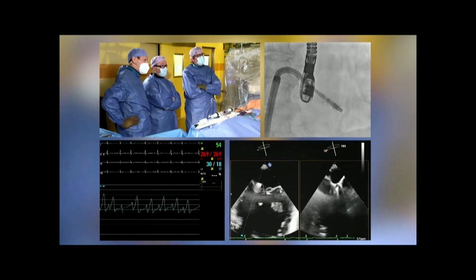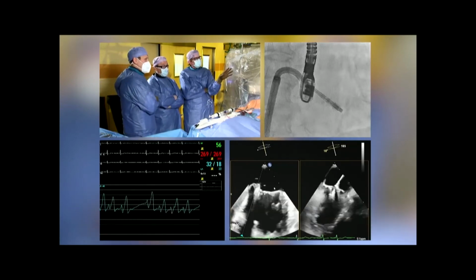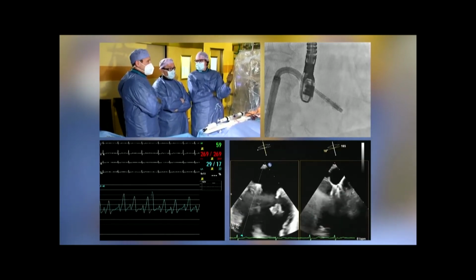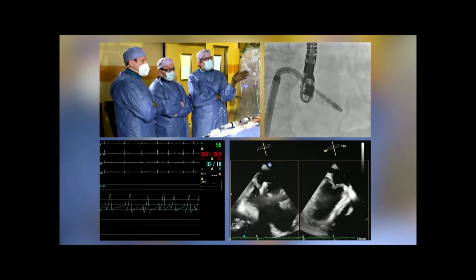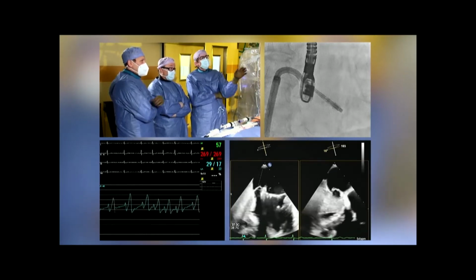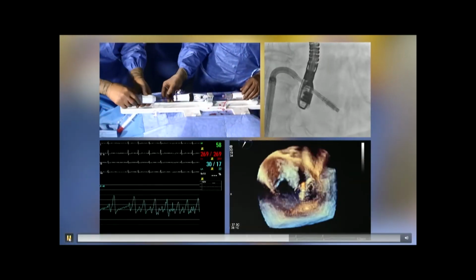So it's all perfect now, but I think we also have to respect the anatomy and what we are seeing. So we see still some prolapse left medially, and I think it will be more stable if we go medially and then place another one next to it laterally. You agree? There's no pathology lateral to it. So bit of MR though. Yeah. Okay, then we open the device.